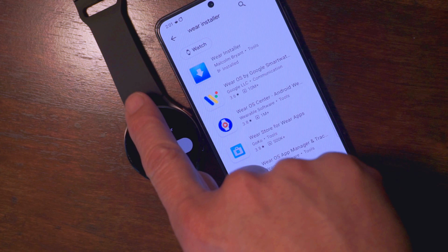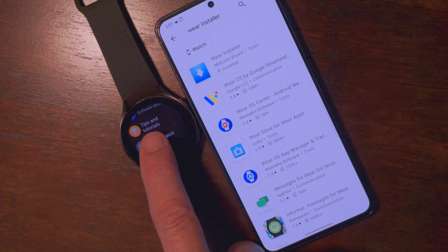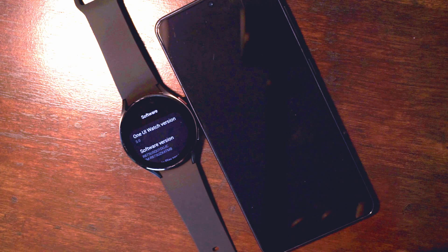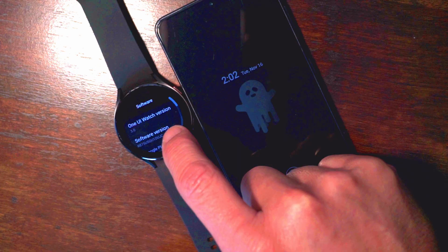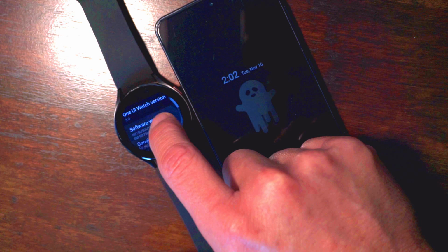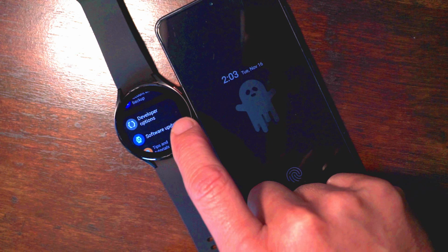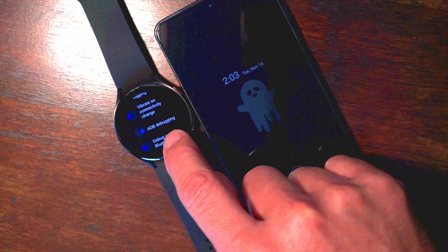Next, from your watch, you'll swipe down to go to watch settings. Tap About, and then Software. From this screen, you can unlock developer mode by tapping on software version 7 times. Now go back to your watch settings and you will see a new option called developer settings. Click on that and then scroll to ADB debugging and tap the blue dot to toggle it on. Now scroll down and also toggle on the debug over Wi-Fi option.